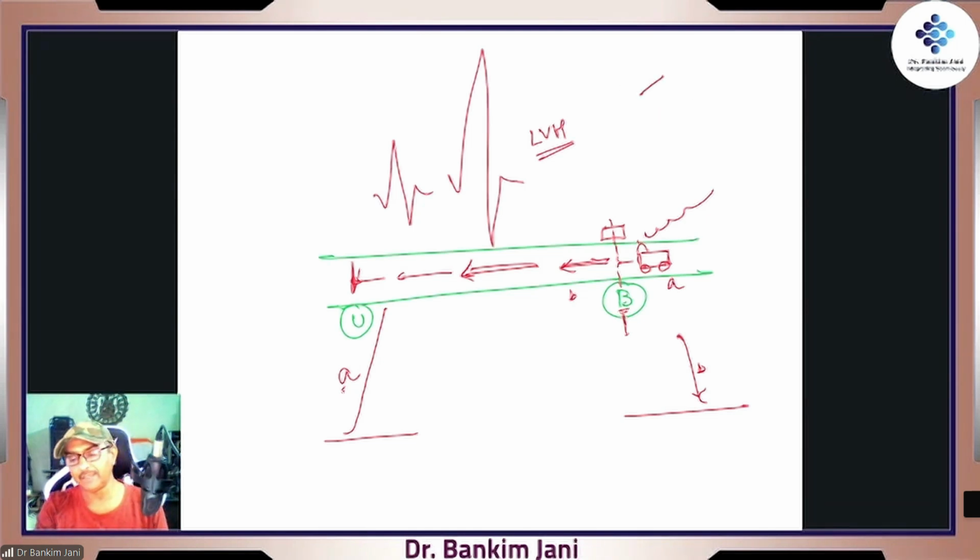So we'll be learning it in every way, what is the speed, what is the regularity, right? Is the SA node constantly firing? Then it is regular. If the SA node is not firing properly, 2-3 fires, and then it takes a gap, and then the AV node comes in, so there is atrioventricular dissociation. They both are beating at their own rhythm. Yes, we see the ECG, and within 5 seconds we'll be able to tell that. Right now, it might look like a jadoo.